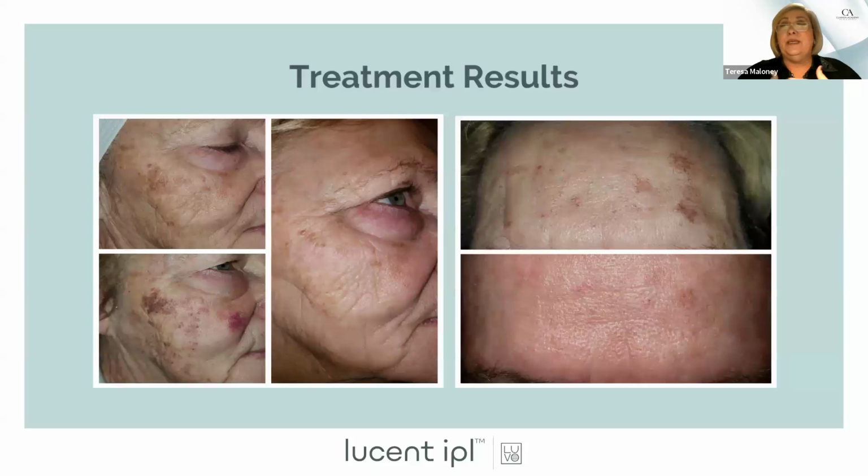So if you start seeing the redundancy in my treatment plan, with pigment: 640 toning, 515, 640 toning, 515. I just adjust my 515 parameters depending on where I am. They're gentler if I come off the face and way more aggressive if I am on the face. You don't need 1,000 combos to do it, but those are the go-to filters for anything we're doing when it comes to pigment.